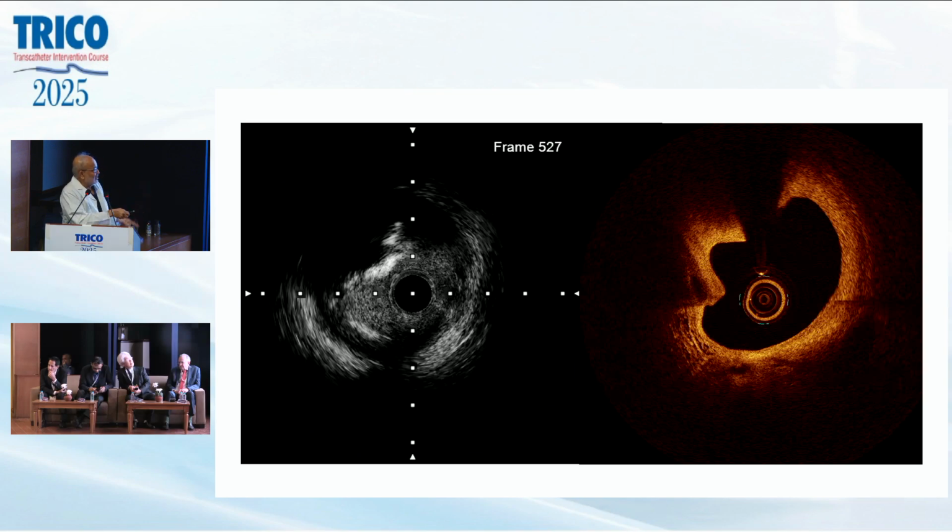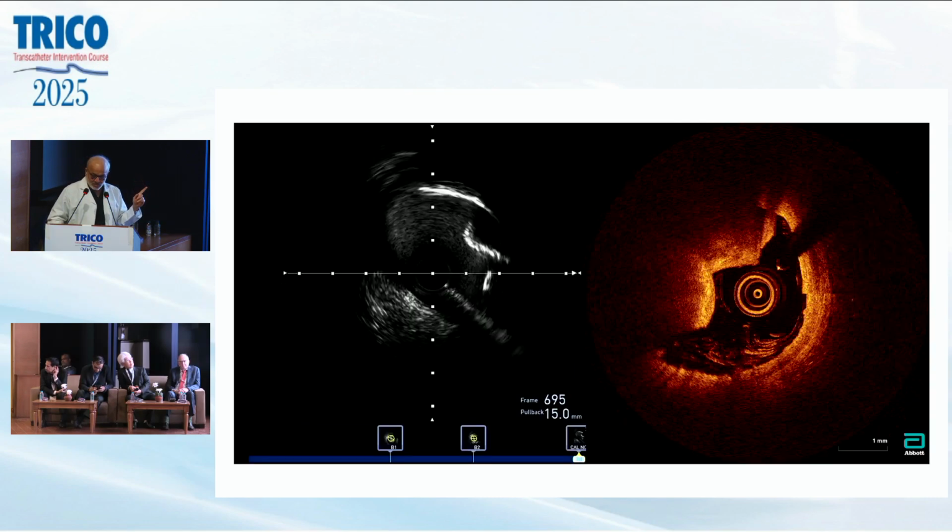And here, this case, if I have to work on this type of nodule in a critical lesion, or even otherwise in a stent deployment site, I will be using orbital atherectomy. Even rota you can use, but rota goes straight in the line. Orbital atherectomy moves around the circumference, so it will shave this area to keep it a little blunter, and then expanding with a high-pressure balloon, it may work. I'll show you the examples too.